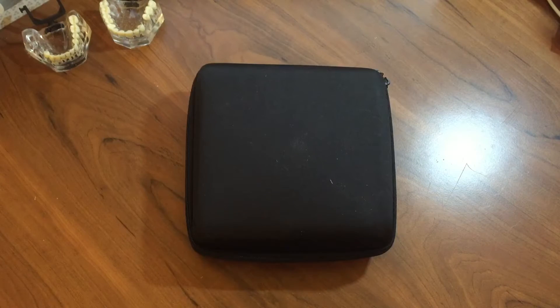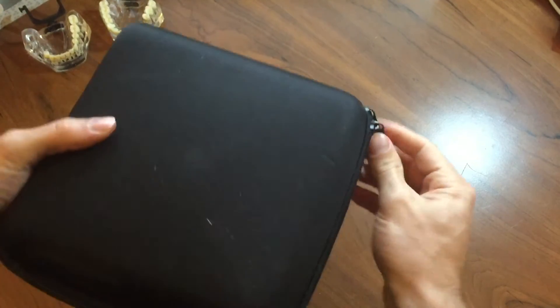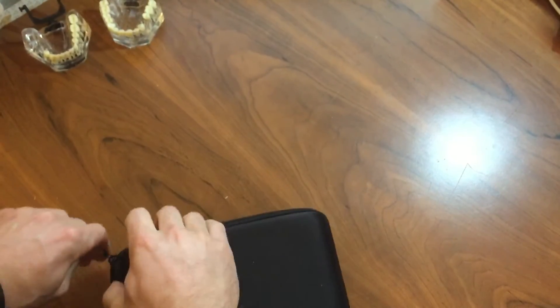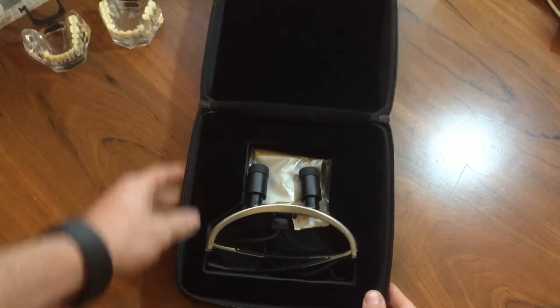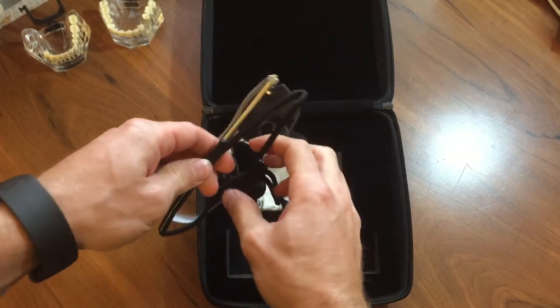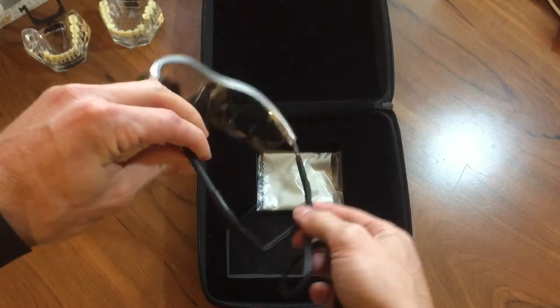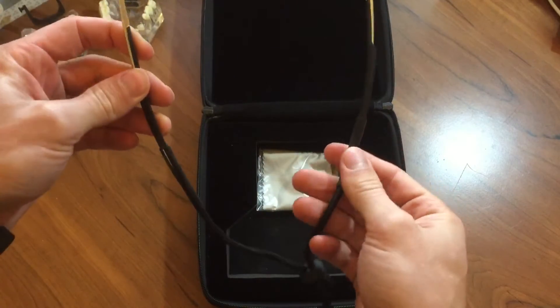I just got these in the mail last week and it came in this nice sturdy case. And when I opened it up, this is what I found — a nice molding for your loops to go into. Here are the actual loops that came with a neck strap. It was not attached so I just attached it. These came attached so you don't have to have them on if you don't want to.